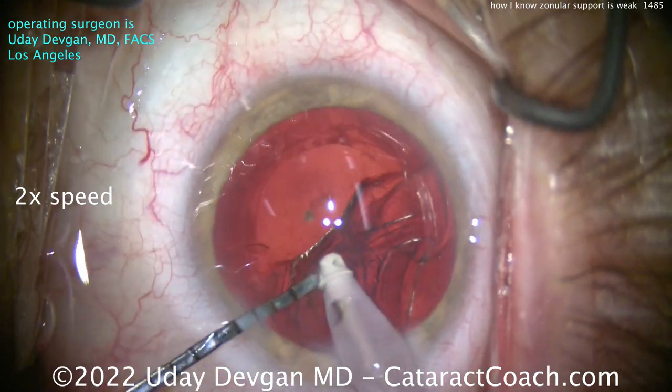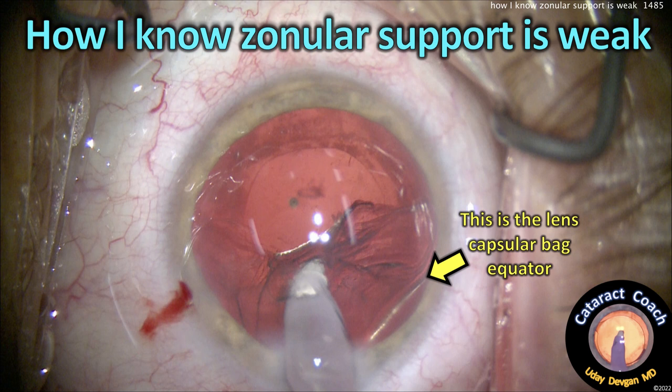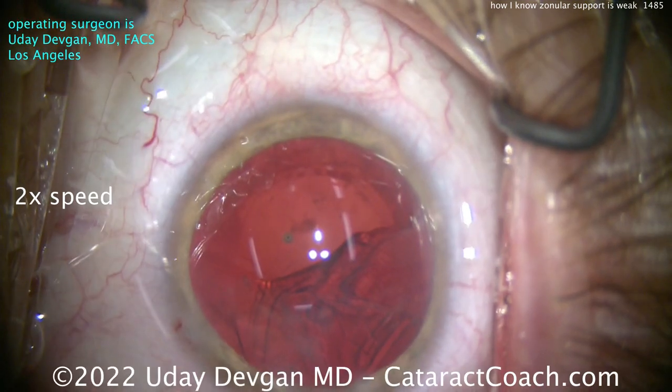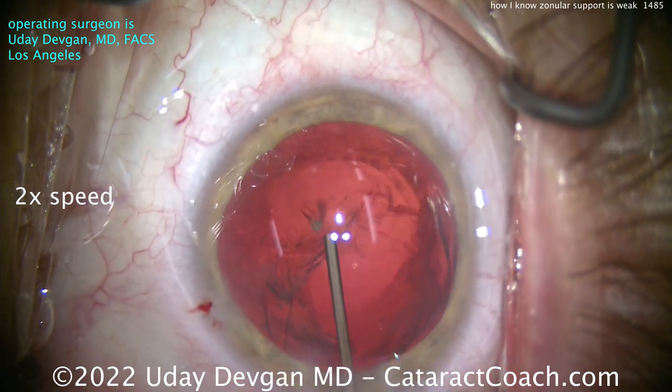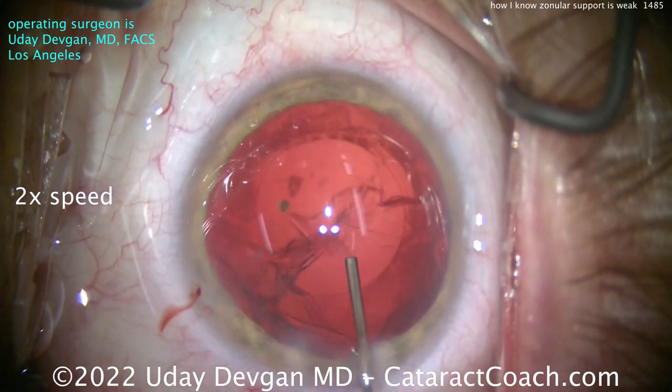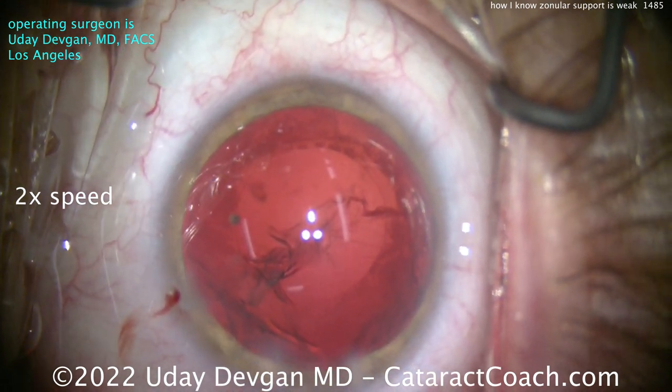Look — that's the lens capsular equator! Whoa, whoa, whoa — that's the equator. Let's let go and come out of the eye. Right there is the lens capsular bag equator. I'm also noticing that fluid was getting behind the capsule in front of the anterior hyaloid face, causing the bag to be more collapsed and shallower. So I'm going to inflate the bag with viscoelastic right now. There's still cortex in the eye.